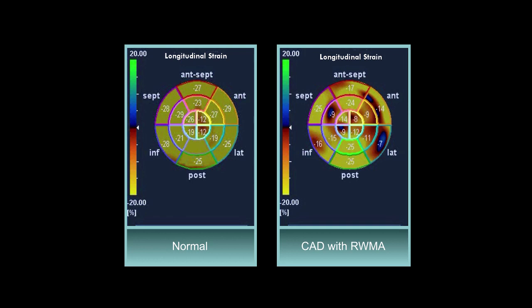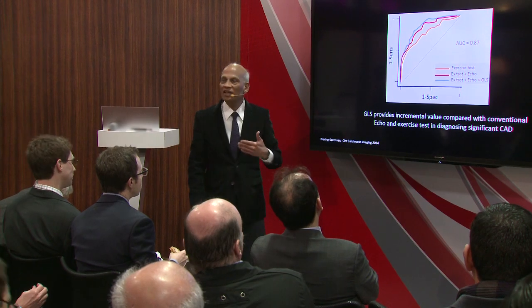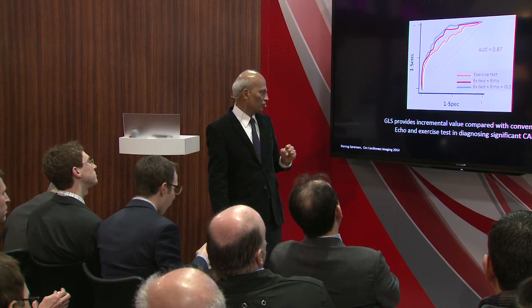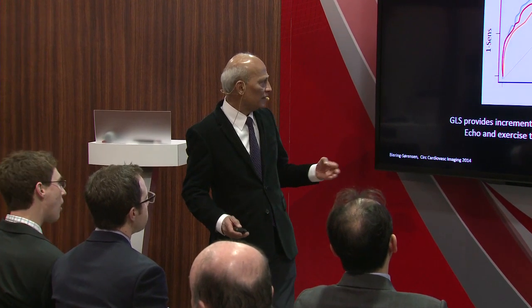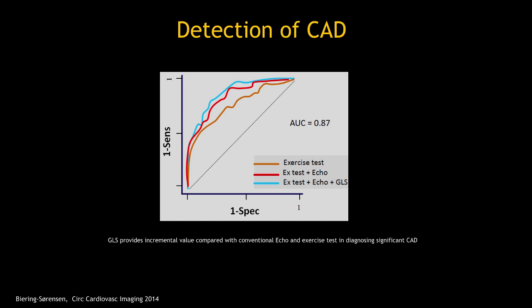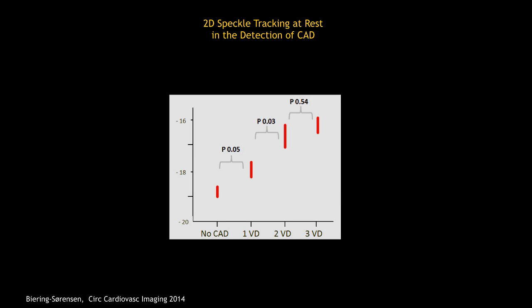Another patient shows multiple abnormal regions — a patient with multi-vessel disease. Beyond recognition of regional contractile abnormality, we also get global EF information. In the detection of coronary artery disease in patients with anginal or chest pain symptoms, global longitudinal strain compared to exercise test with conventional echo provides the maximum sensitivity and specificity on the receiver operator curve, correlated with coronary angiography.